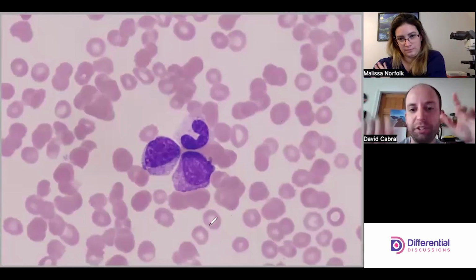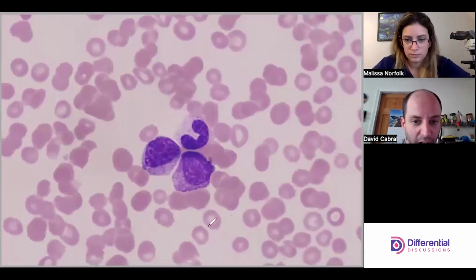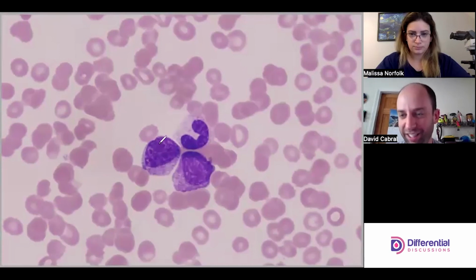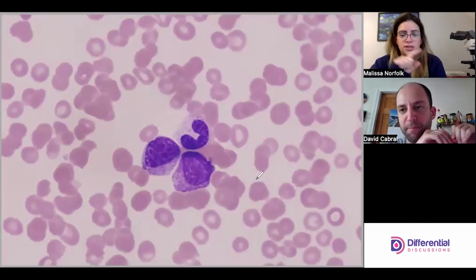So now the others. Yep. What's interesting about these two cells is the one on the right hand side, the nucleus looks less mature than the other cells around it. I don't know about the granules. They're kind of difficult for me to make out. Do you think that this is transitioned from pro to myelo at this point? Oh yes, yeah. I think they're both myelos. Okay. I think this one's just less clumpy. Yep. And this one's got way more of these dark purpley clumpy areas in here. But I think they're both still myelos. Yep.